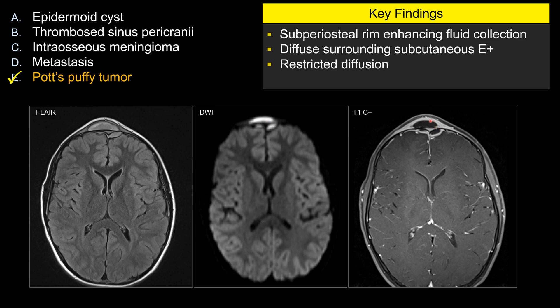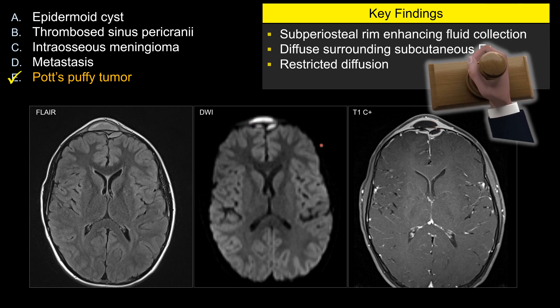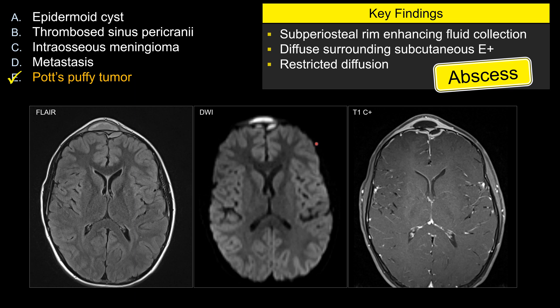A rim-enhancing collection with restricted diffusion sounds like we are describing an abscess, and that is exactly what this is. Probably the most important thing to note is that there is an epidural abscess. This fluid collection is continuous, as you can see on FLAIR, and it crosses the midline. If this were a subdural abscess, a subdural fluid collection would be stopped by the falx and extend along the falx, not cross the midline. So this is an epidural abscess.